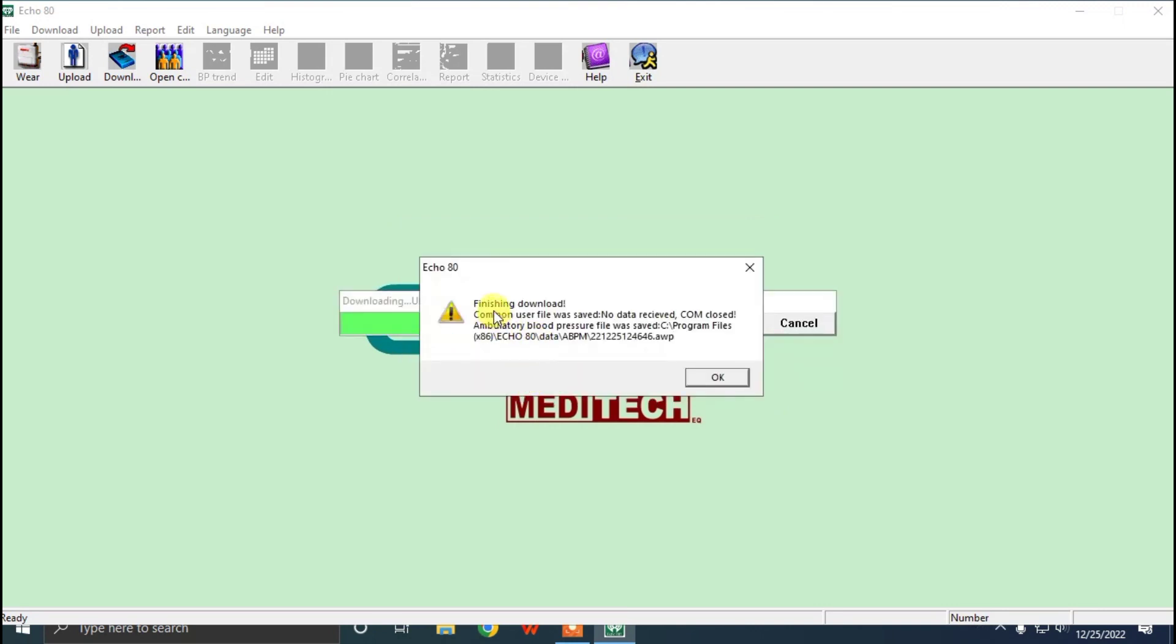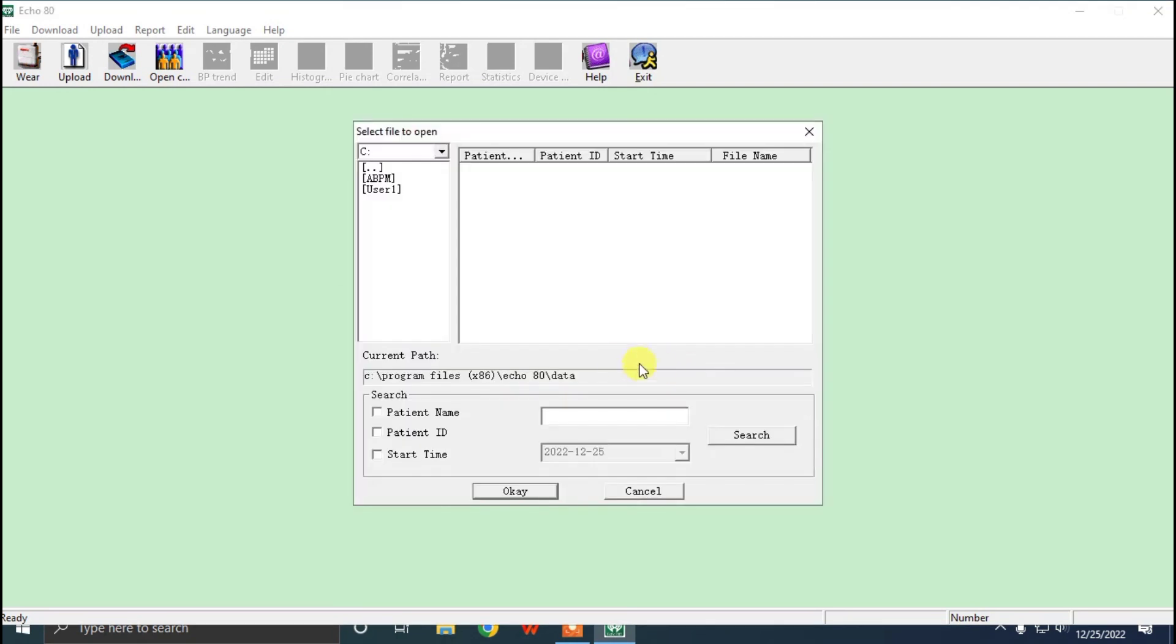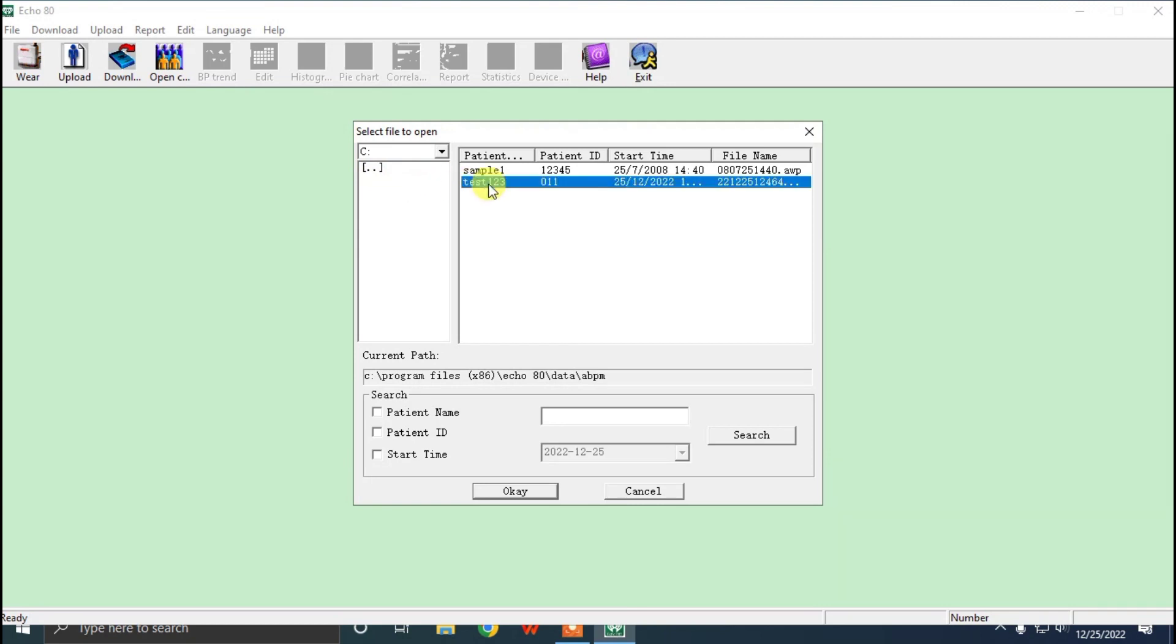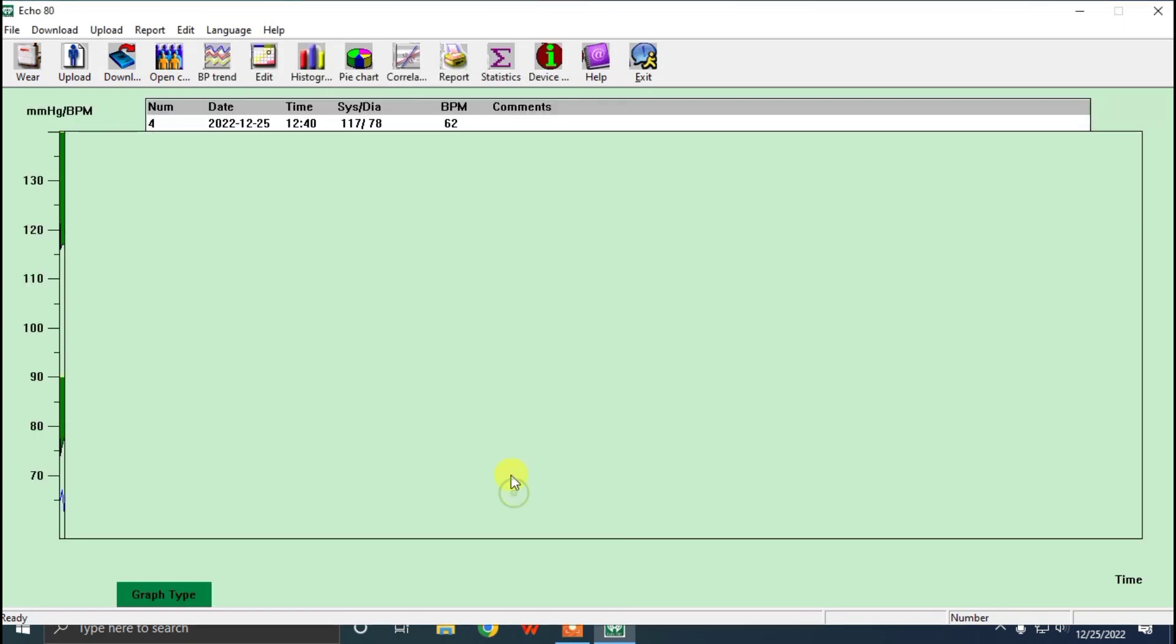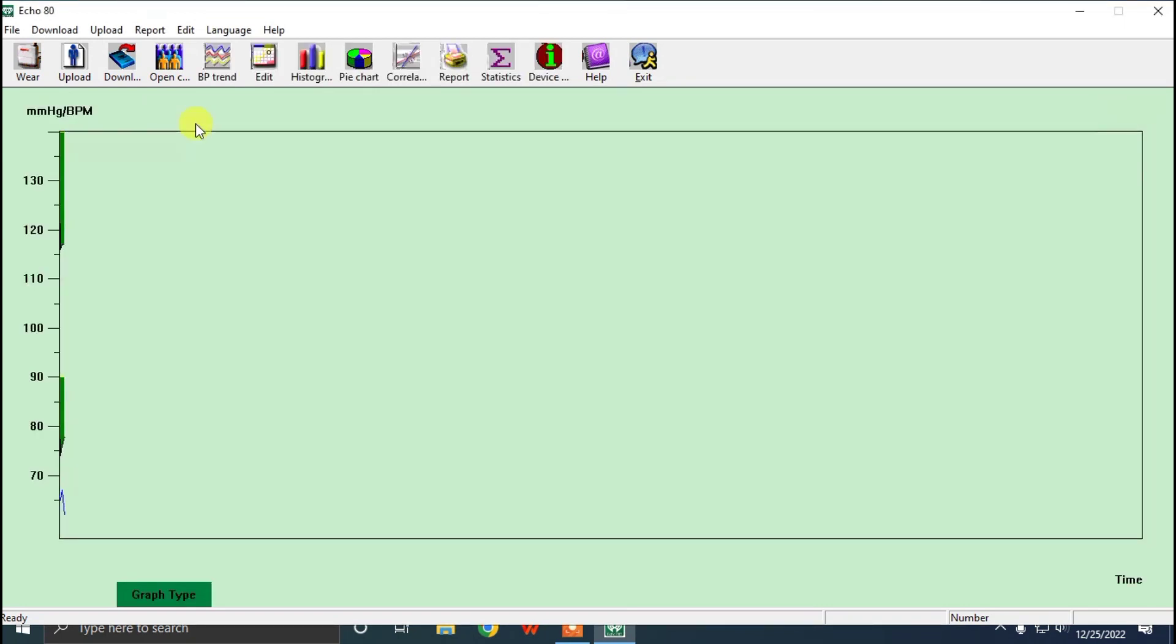After that, we can go to ABPM, and in that we have test 123, the patient name which we have entered before. So clicking it, OK, and we can get the data of that patient.